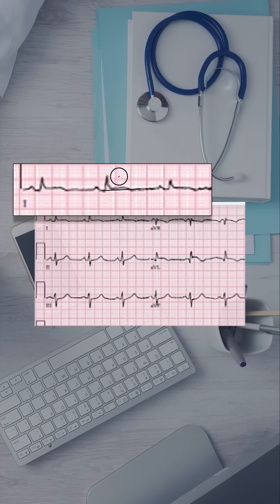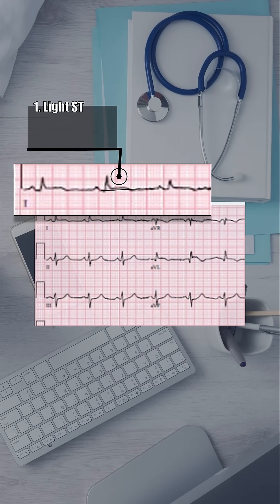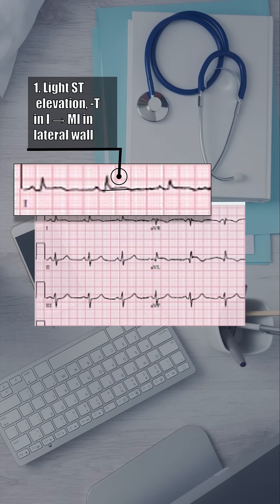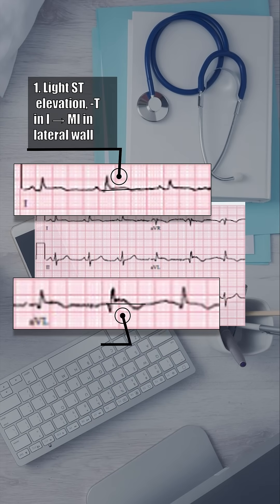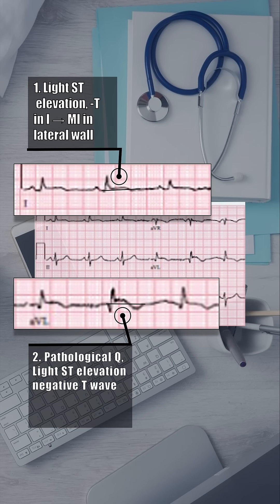Now let's look at his ECG. There is slight ST elevation and negative T waves in lead I. In AVL, there is a pathological Q wave with the same ST changes, suggesting lateral wall myocardial infarction.